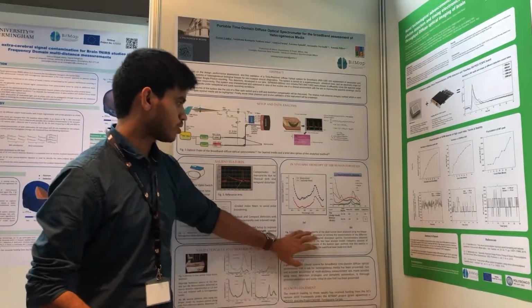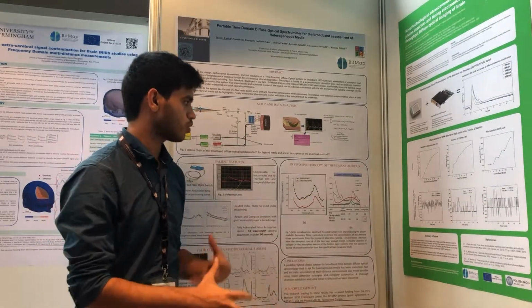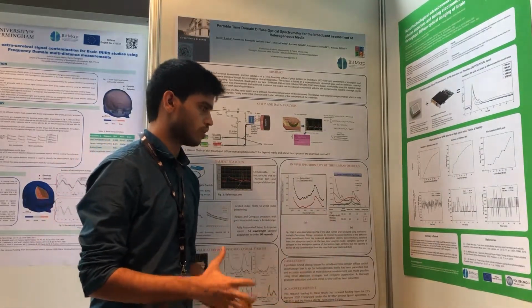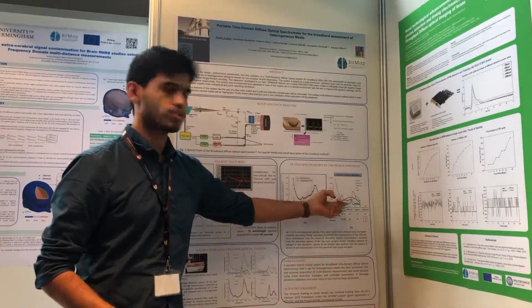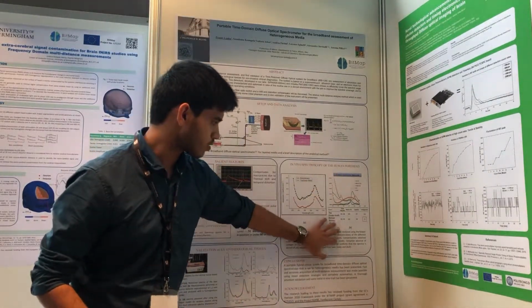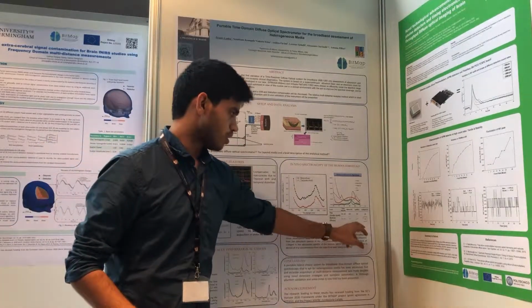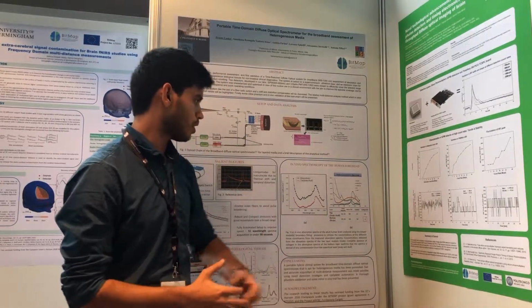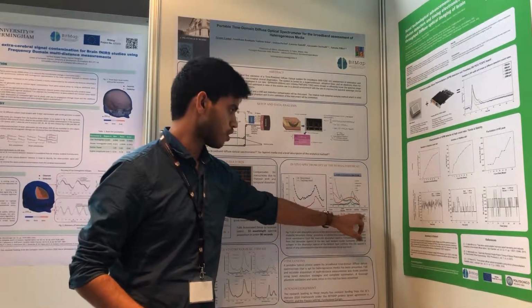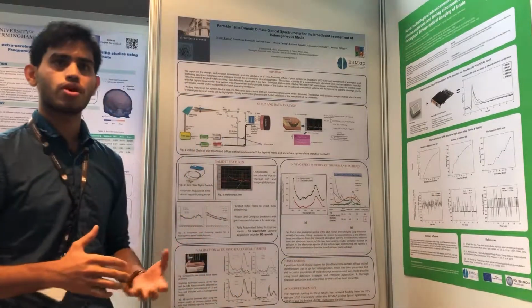and the underlying layer we see is predominantly brain. When we use this particular absorption spectra and try to perform tissue constituent concentration retrieval using a linear fit of all the tissue constituent spectra, these are the results that we got. One really interesting result here is regarding the retrieval of the collagen content: in the top layer you see some significant amount of collagen, but in the bottom layer, which we expect to be the brain, we see literally no collagen content.